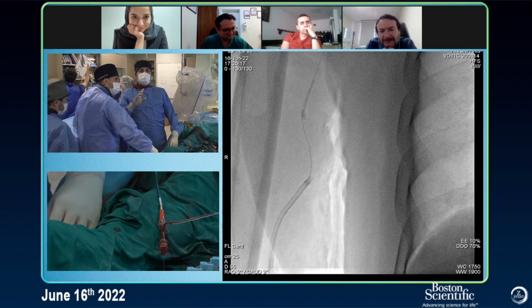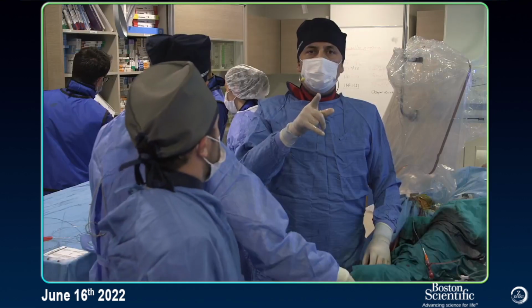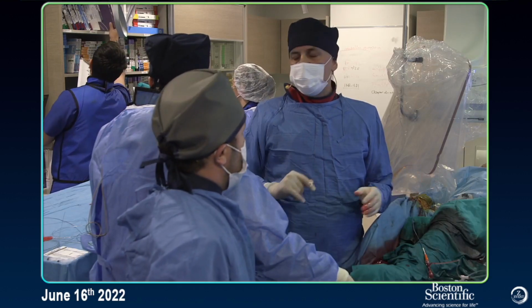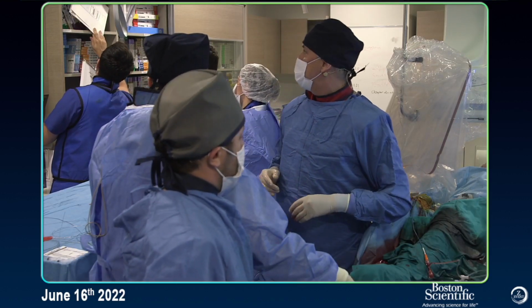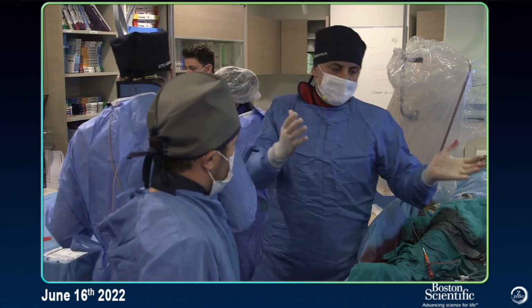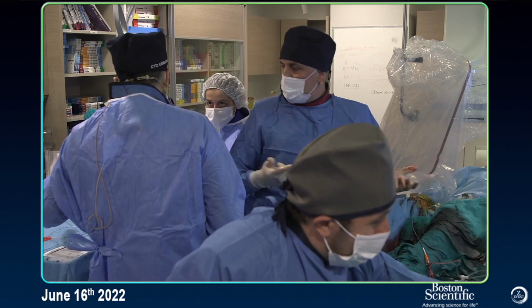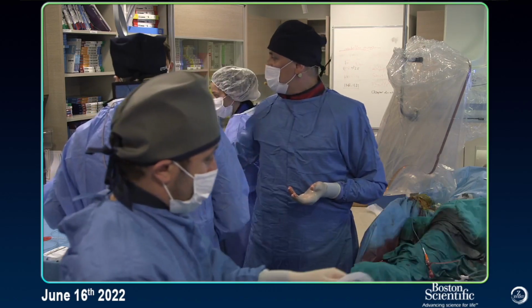No, it happens in front of your eyes, okay? I don't think we did that much aggressive behavior. So it's not on you. I mean, it could. Sometimes I could force more, but I didn't. I'm saying that, you know.